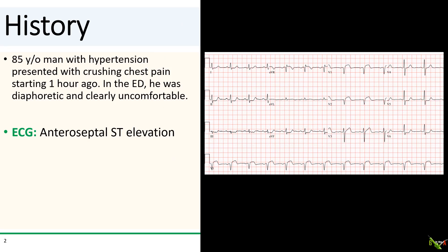The patient is a very robust 85-year-old man who presented with crushing chest pain after lifting at the gym about an hour ago. In the ED, he was sweaty and clearly very uncomfortable. The ECG, which you see here, showed anterior ST elevations with infralateral reciprocal changes, and the STEMI team was activated.